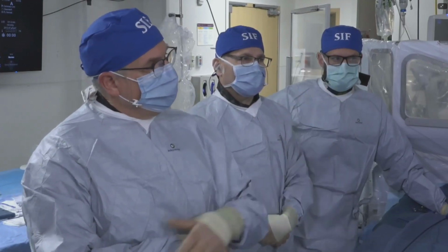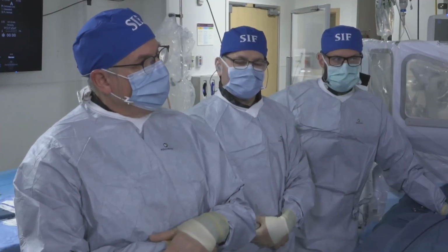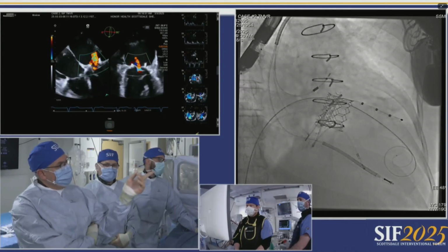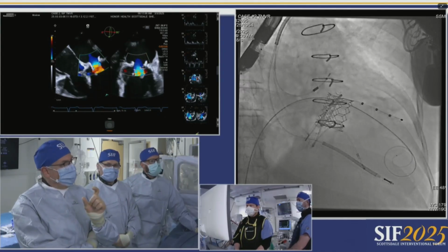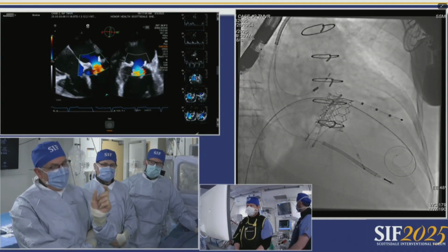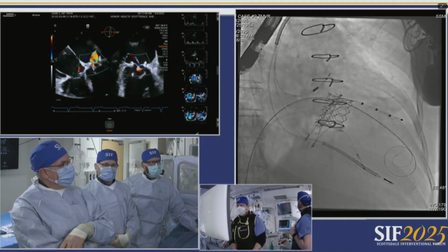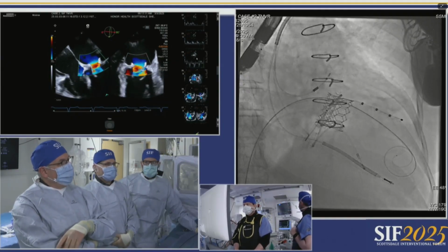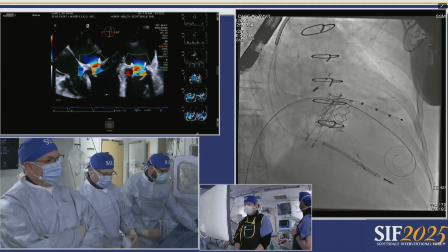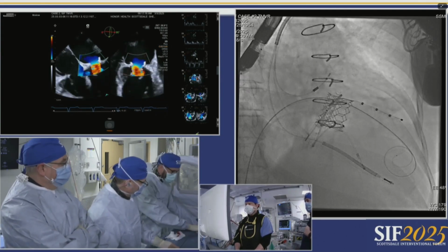We thought we'd use the ventricular side of the 26 and go a little atrial to that. The plan being that the 26 is probably about 20 in length, fully expanded. It's probably a little bit shorter because it's probably not fully expanded. And the 23 is 18, so we want to get that atrial flange well opposed, obviously, as well. From a TEE perspective, maybe I'll hand it over to Dr. Burke and just make a couple of final comments, and then maybe let the panel make some comments as well.